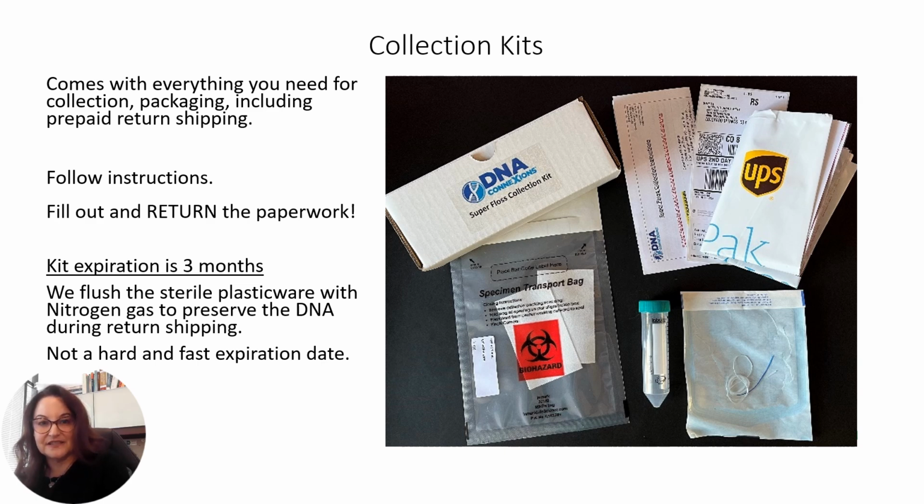The included plasticware with each of our kits has a 3-month expiration date as it is flushed with nitrogen gas to help preserve the DNA during return shipping. This is not a hard and fast expiration date, rather it is based on the laws of gas dispersion. DNA ConneXions can replace the expired plasticware on request.